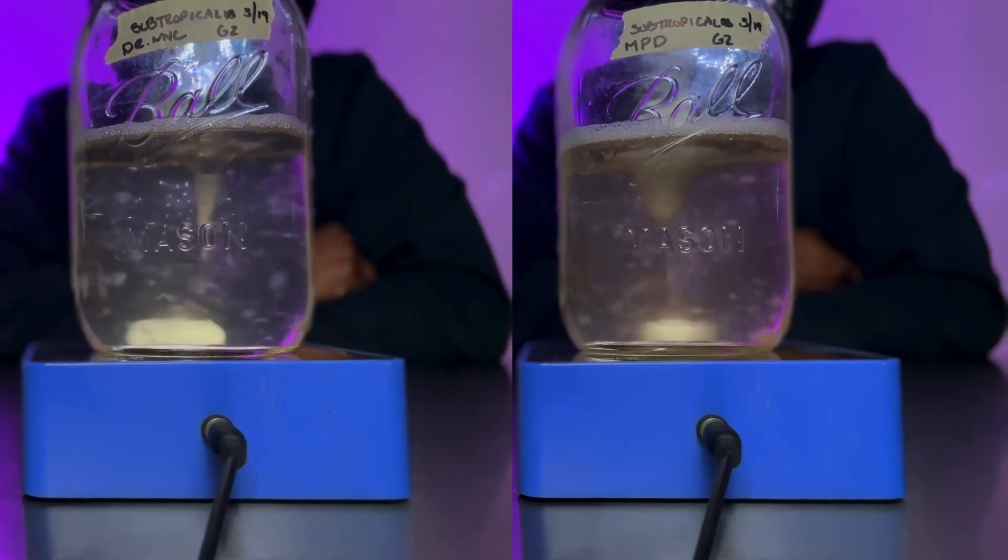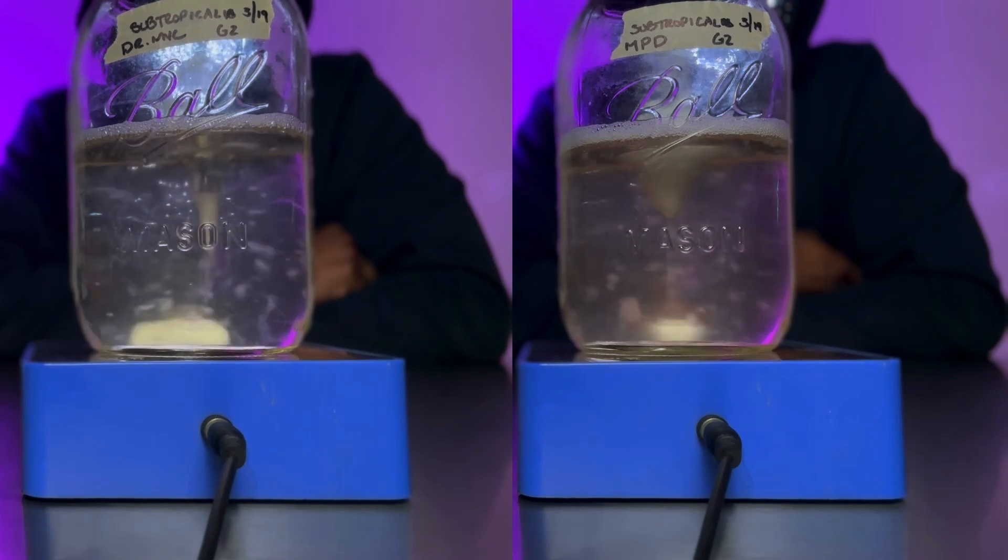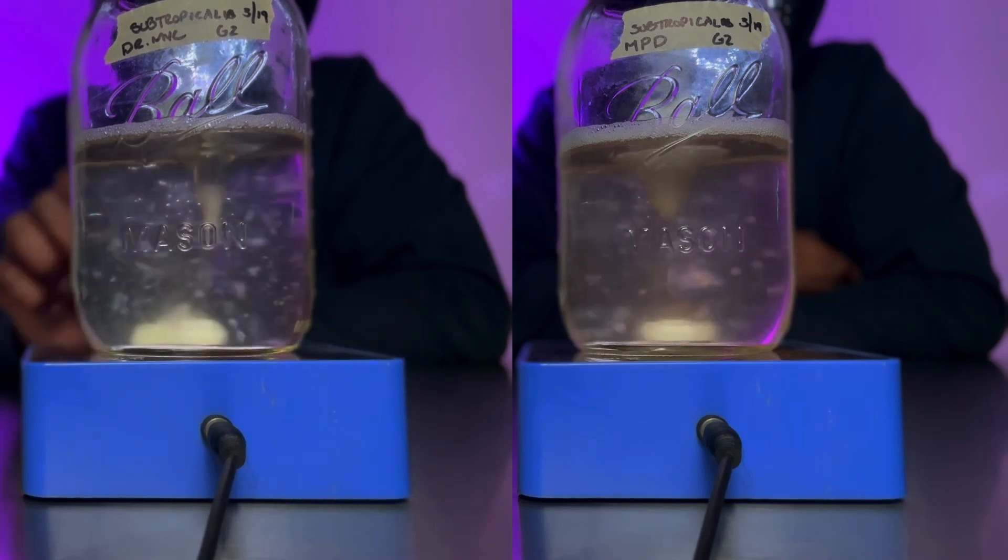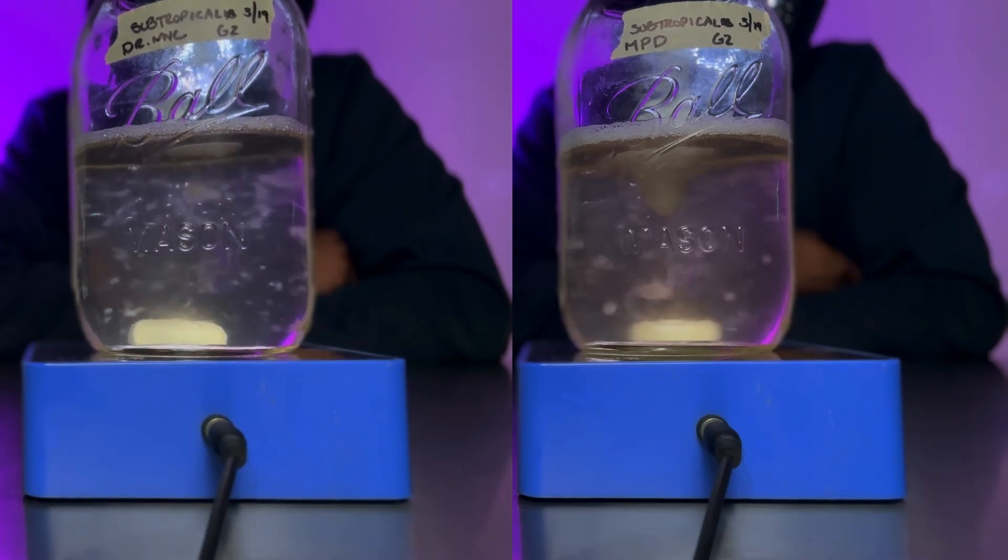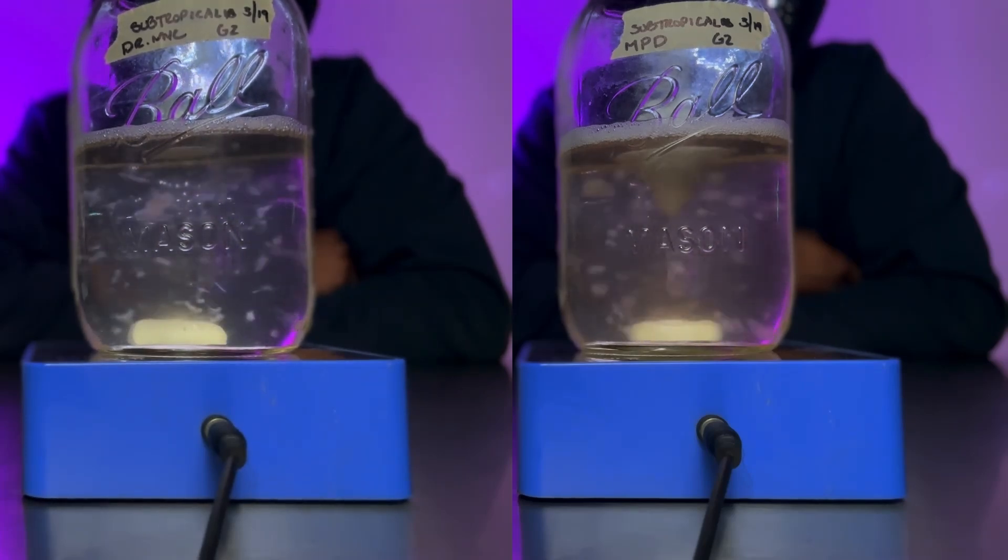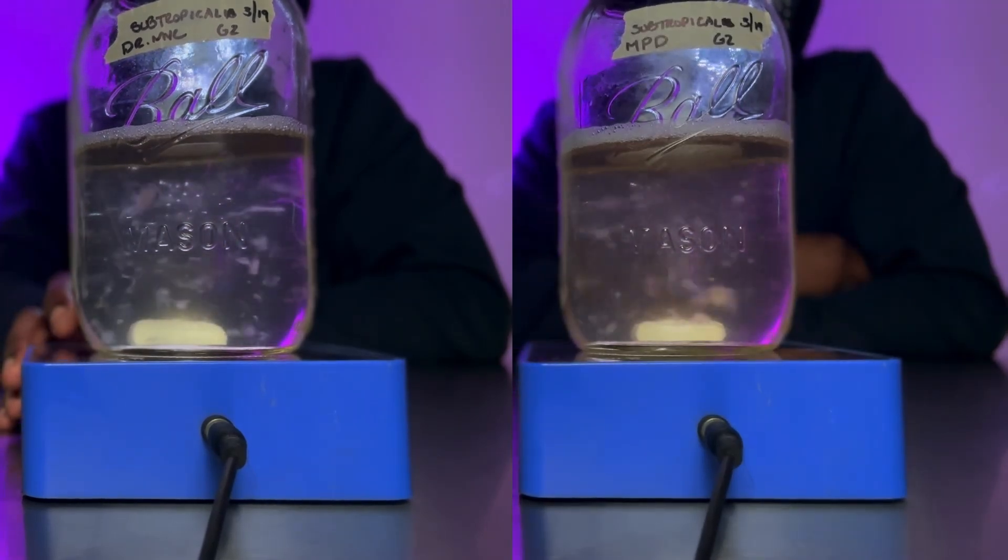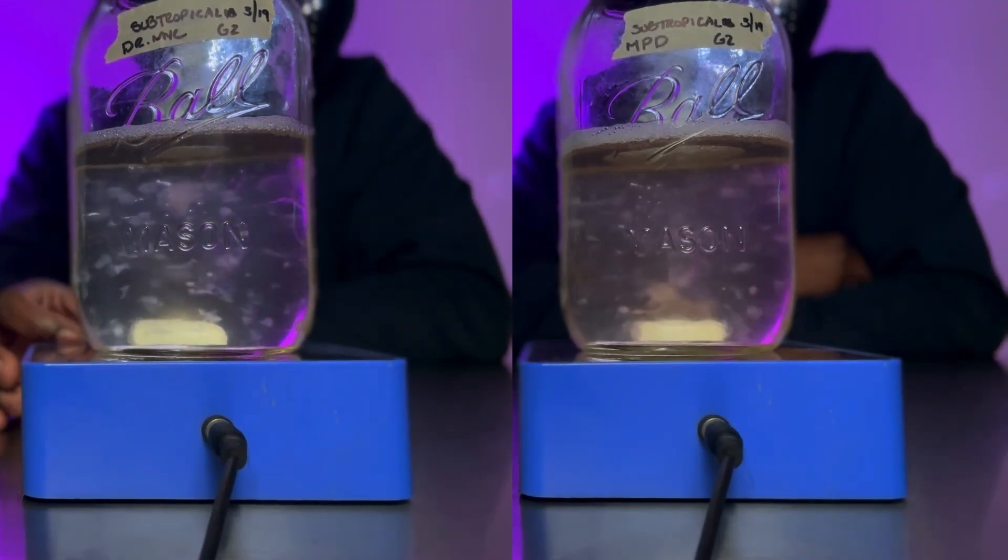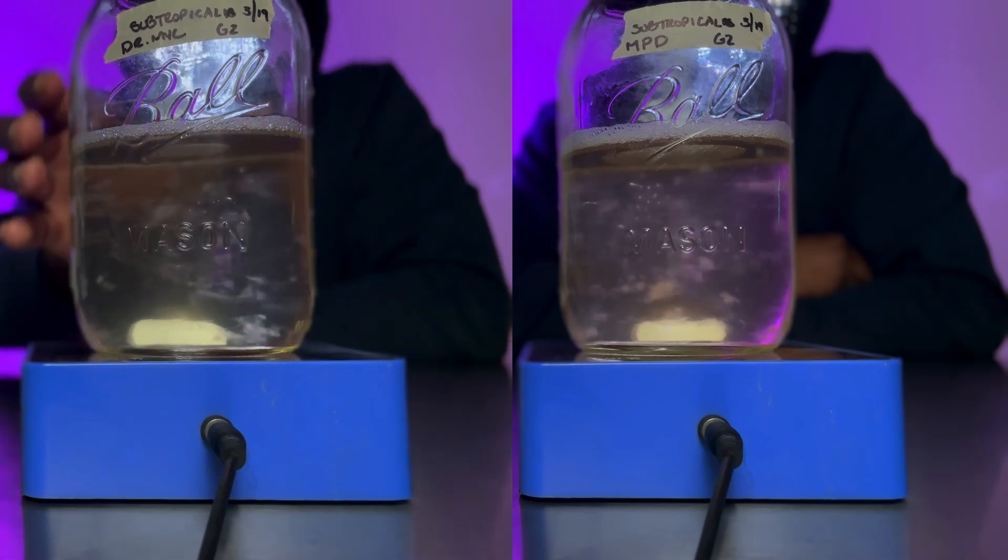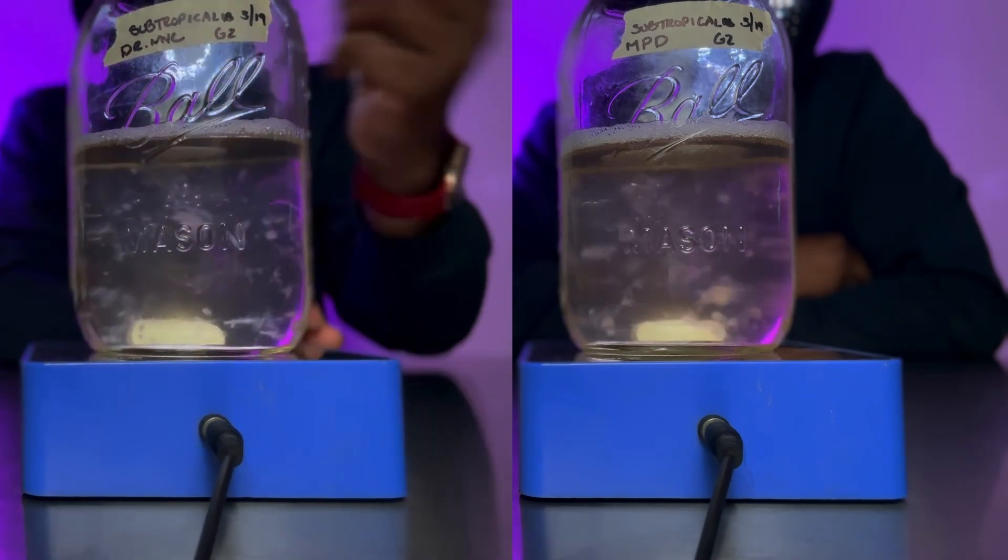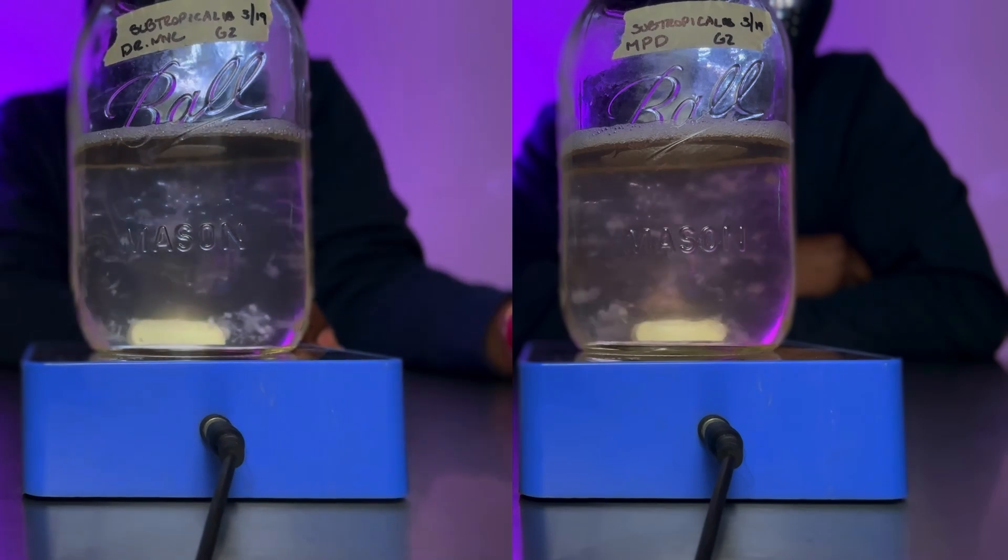So it does look as if our old school MPD liquid culture recipe has produced slightly higher myceliation rates than Dr. Mike's adaptive liquid culture premix. And as you can see here, not only has our MPD jar produced slightly higher myceliation rates, but it has also produced larger three-dimensional constellations of mycelium. But I am not going to say that Dr. Mike's liquid culture premix is a subpar product because it did indeed produce pretty good results, just not better than the old school MPD results.